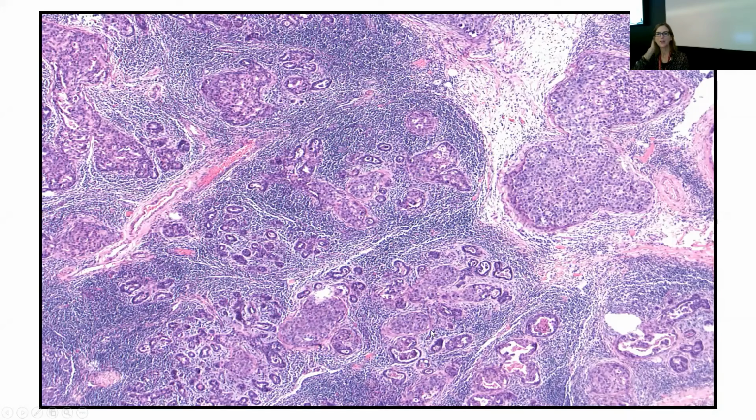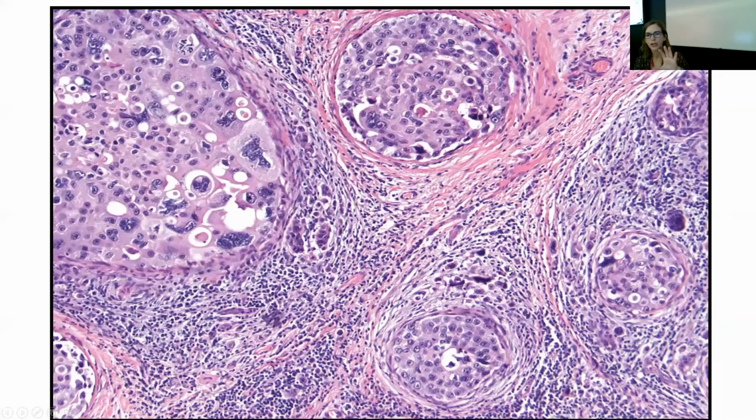And this is that case where you know that there must be microinvasion somewhere, but where is it? So this is high-grade DCIS. It's extensively involving the resection specimen that you have. You've got periductal lymphoid infiltrates. My approach is a low power look to see where there are areas that might look a little different, and where there are larger cells within this inflammation, to try and pick out these foci of microinvasion.